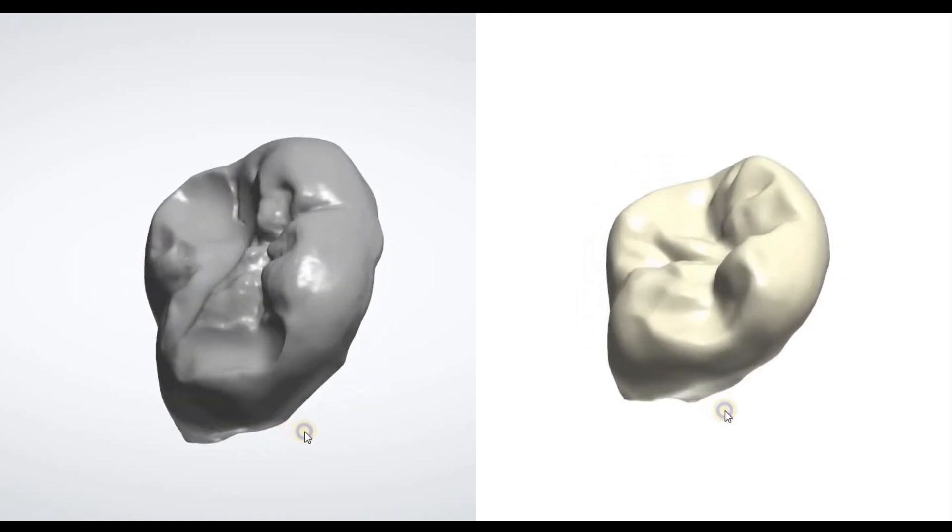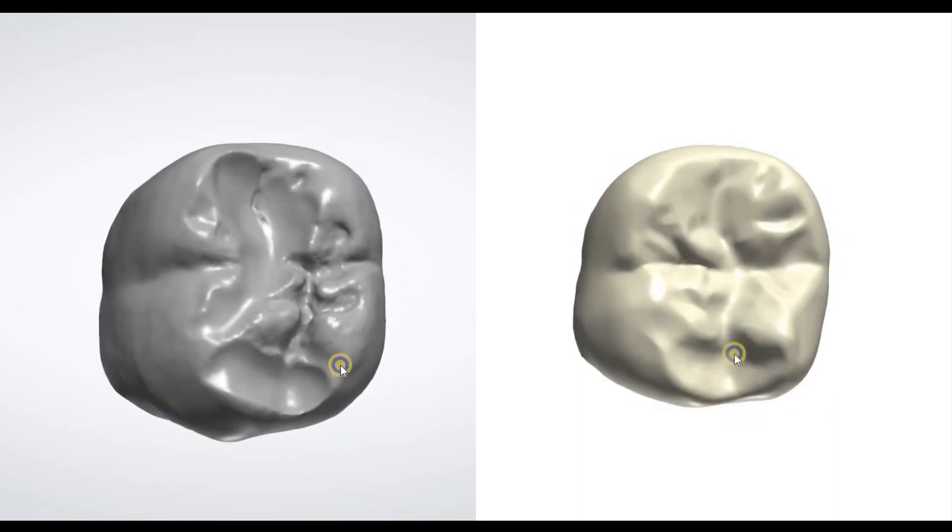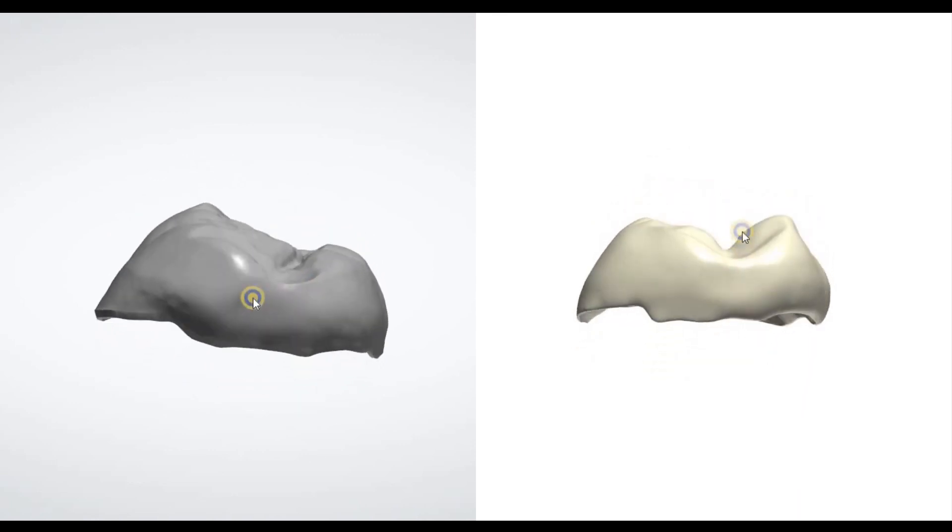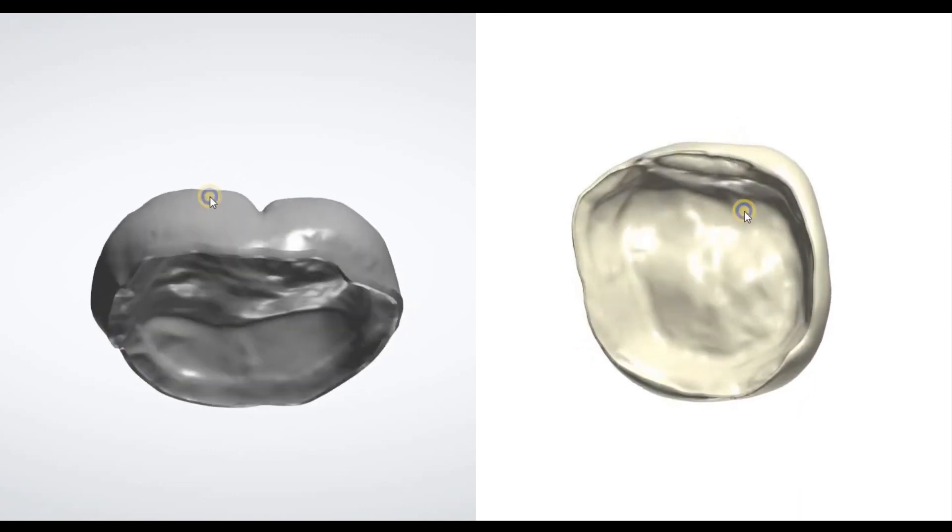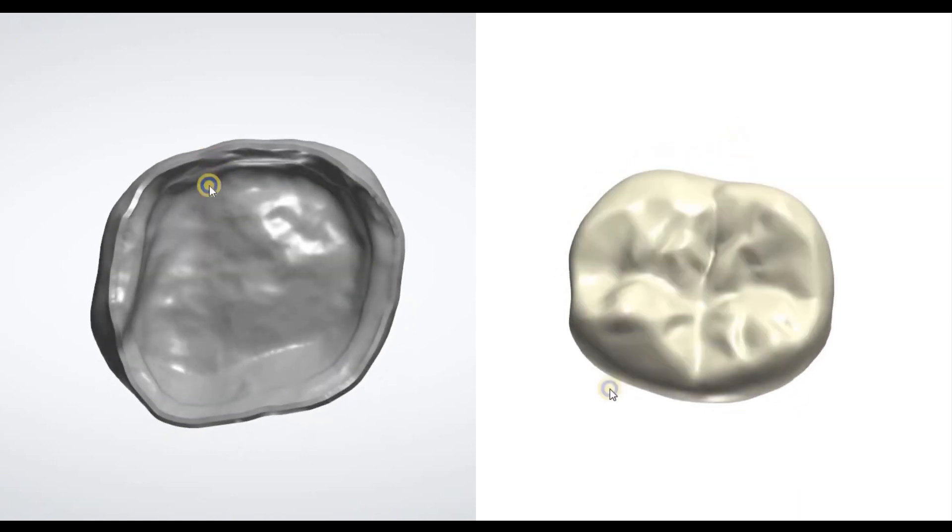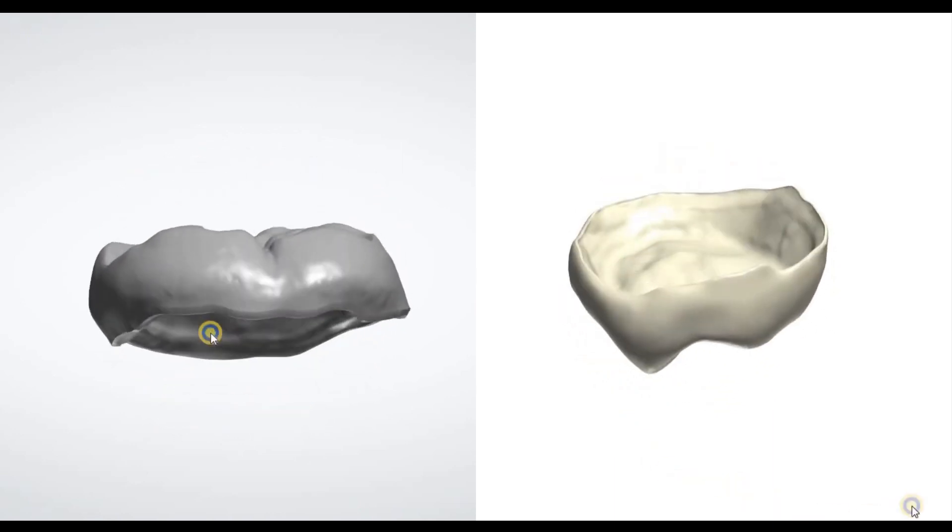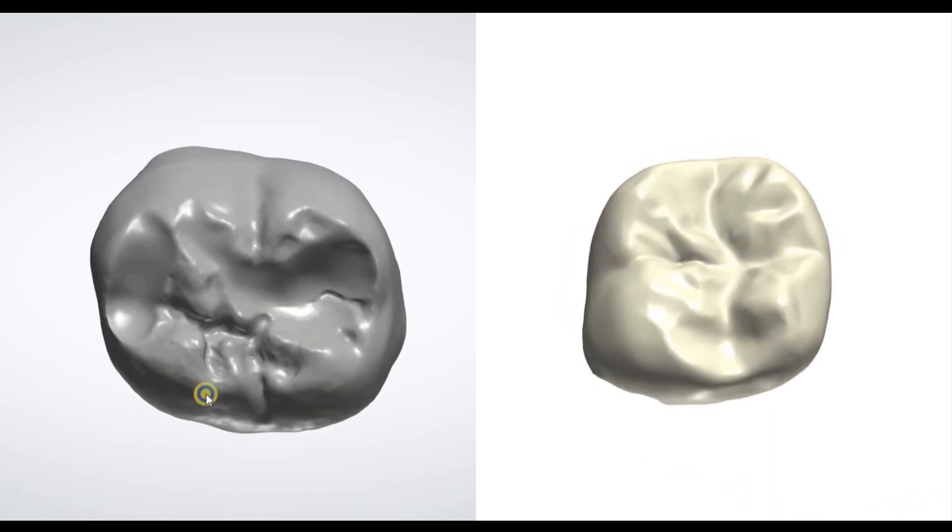What I like about exocad a little bit better is the margin function - you tap on it and it defines it right away automatically. It could be problematic sometimes in three shape.